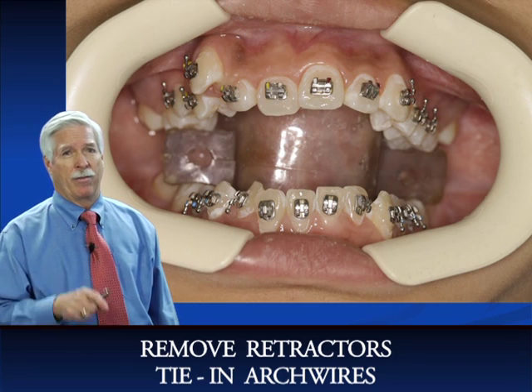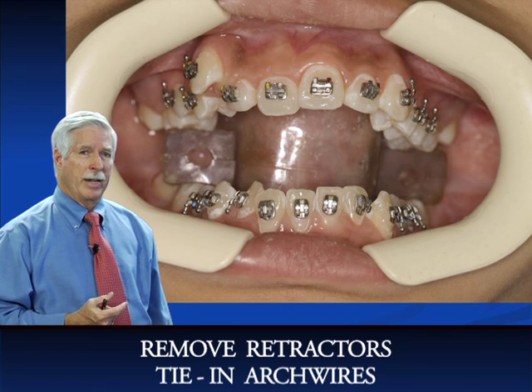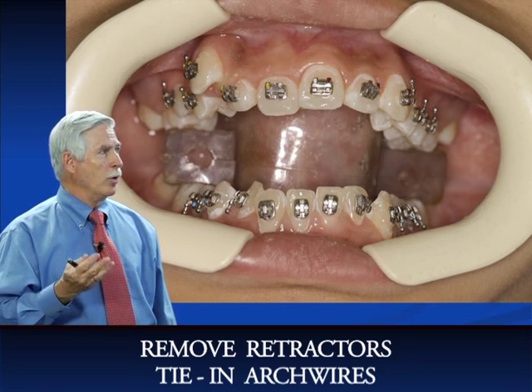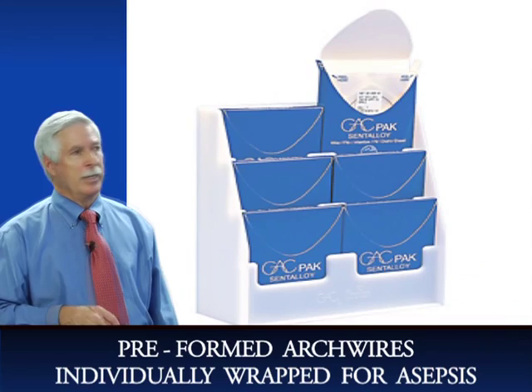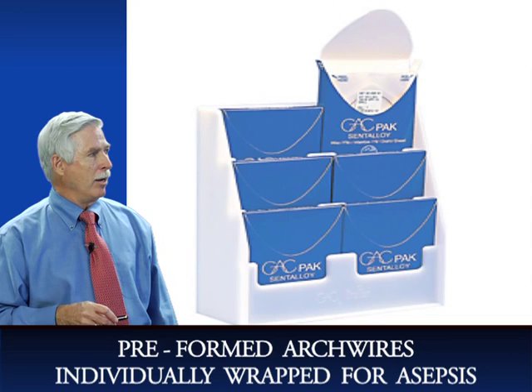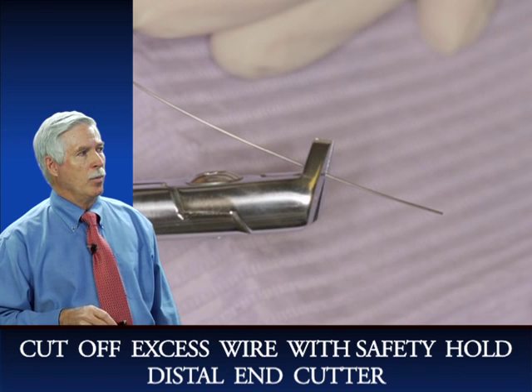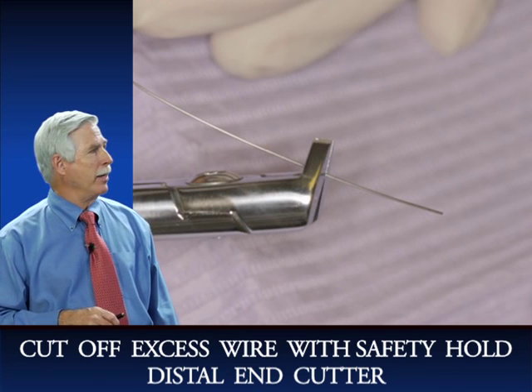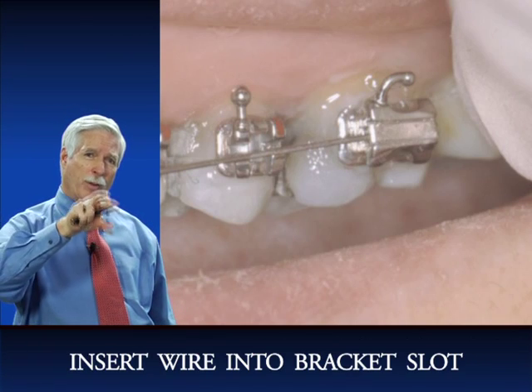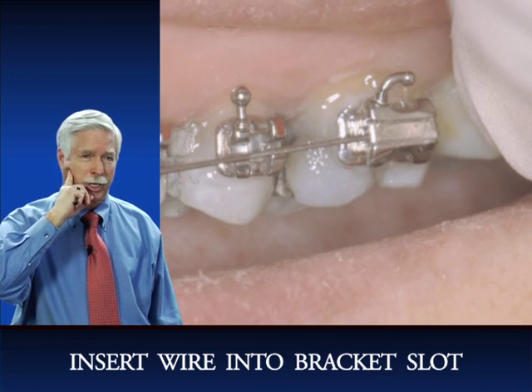Again, if the teeth are badly misaligned, with a lot of crowding, and remember we had that cuspid on the upper right, which was completely labially displaced, we're going to start with an 014 nickel titanium wire. So just take the wire out, and they're all pre-sterilized, and then cut off the excess and then try the wire in. So we cut off the excess with the distal end cutting plier prior to putting the wire in. Cut the excess wire off before you put the wire in, so you won't put it back too far and hurt the patient's cheek.